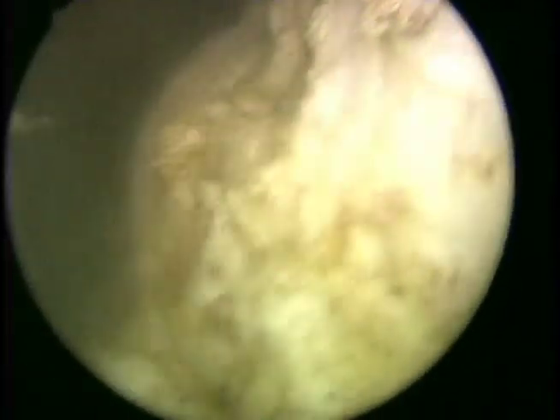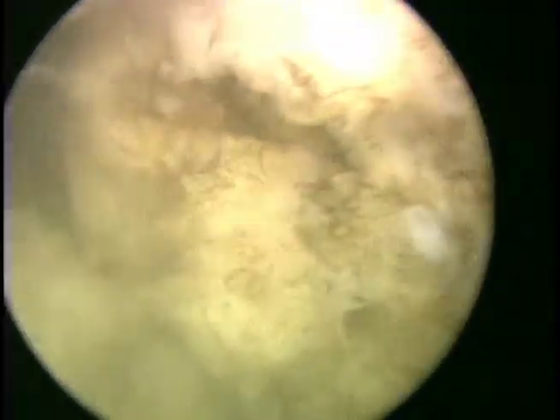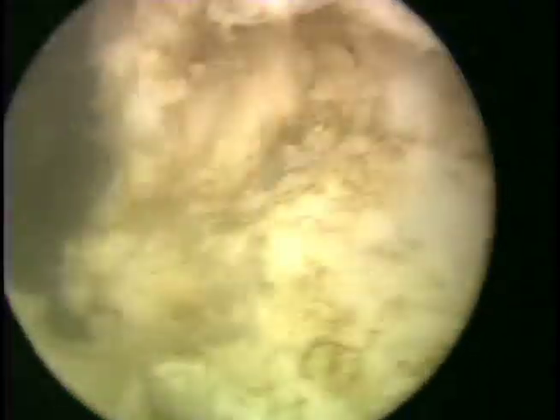We will then use the laser fiber to widen that groove, taking some more of the left lateral lobe as well as the stump of tissue on the floor still remaining. At this point, the power can also be brought up since we are now well aware of where the surgical capsule is located. We will now spend time better delineating that 5 o'clock groove, and again widening it with repetitive sweeping and withdrawing motions.